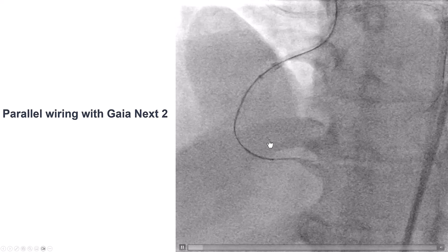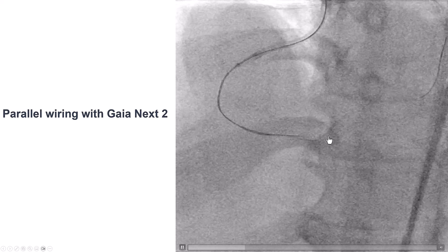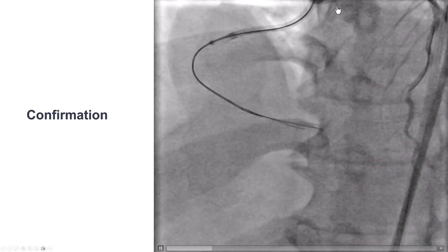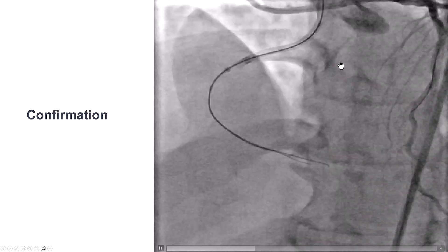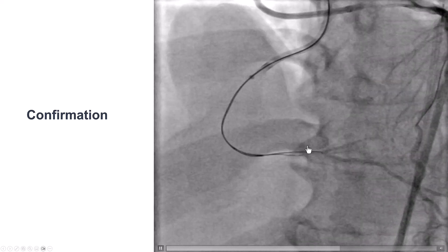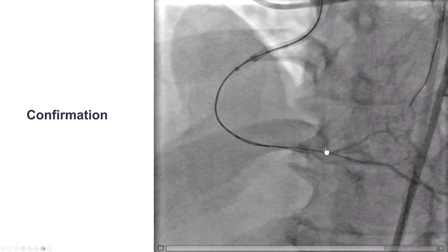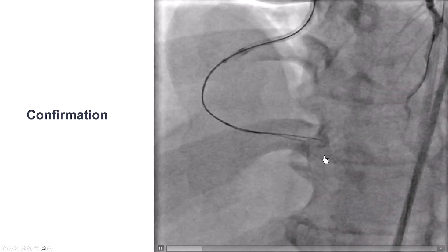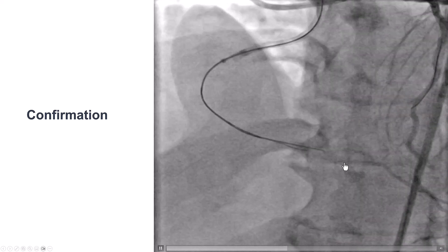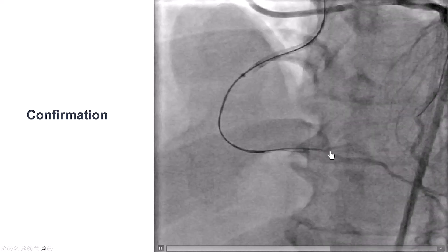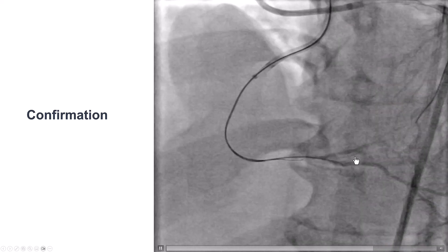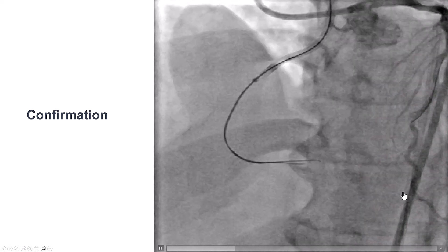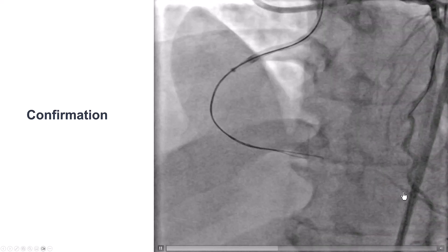In this case, the Gaia NEX2 seemed to go in the right direction. This is a contralateral injection, and here we can see that the second wire, the Gaia NEX2, is in the true lumen. We also advanced it during the injection, confirming that the guide wire is moving freely inside the distal RCA and the PDA.